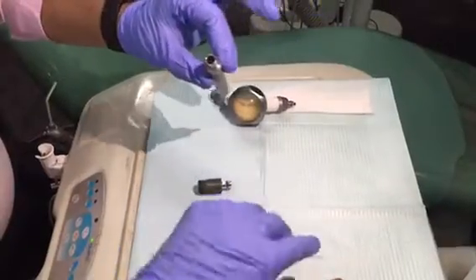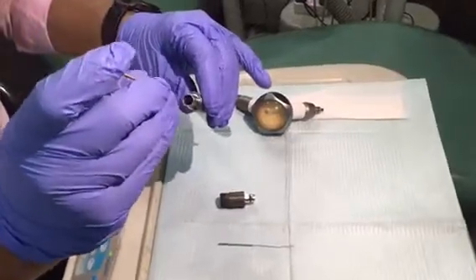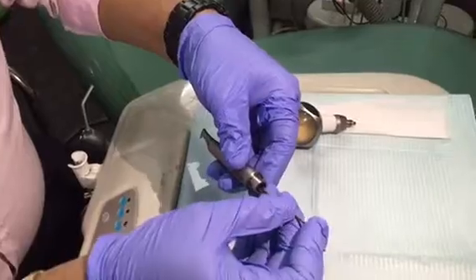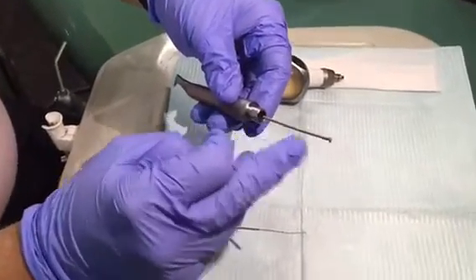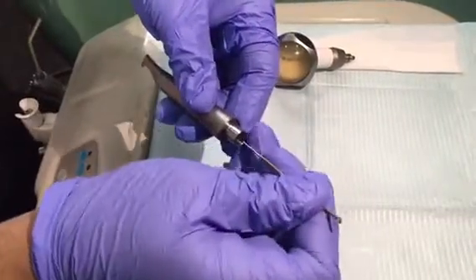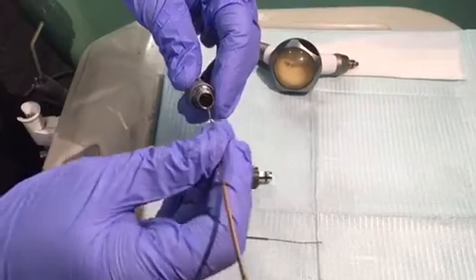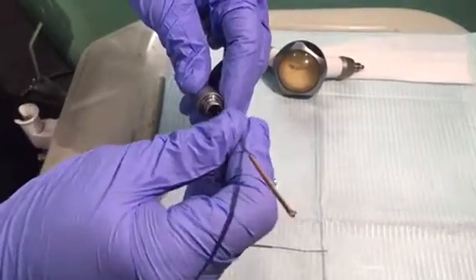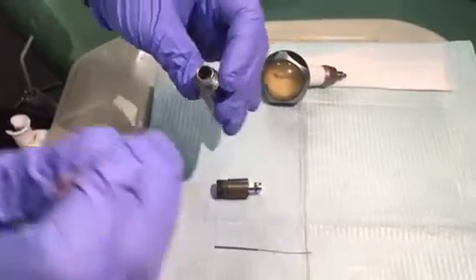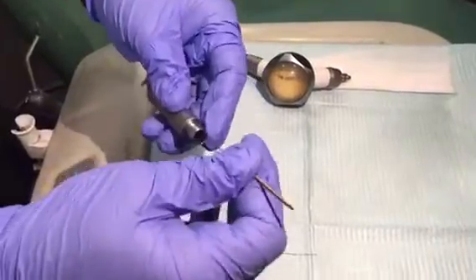Now the important part is to clean this head. You take the bigger needle, insert it from behind exactly into the hole, and make sure it reaches till the brown mark. Do this two or three times, because this is the area where it gets blocked with the water and the powder. In case this gets blocked very badly and the needle is not able to go in, you can add a drop or two of hydrogen peroxide and then do this. It should get cleaned up.